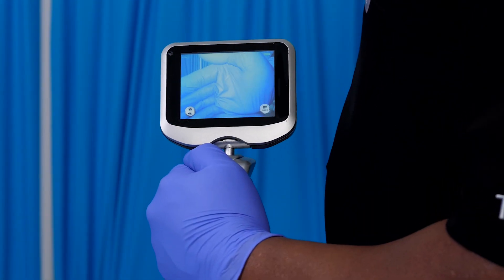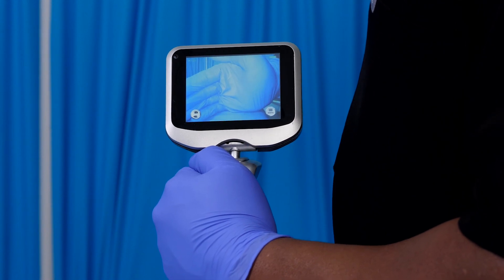At this point, you'll want to confirm the image from the camera is displaying normally and clearly on the screen.